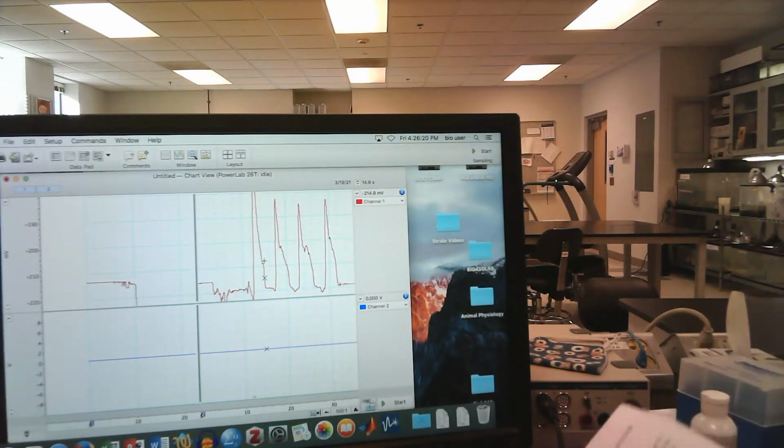Well, this is where calculus actually comes in handy. We can get that by integrating. The great thing is we don't have to integrate this by hand. We can just get the computer to integrate it for us. So what we're going to want to do now is first we're going to want to correct our units.